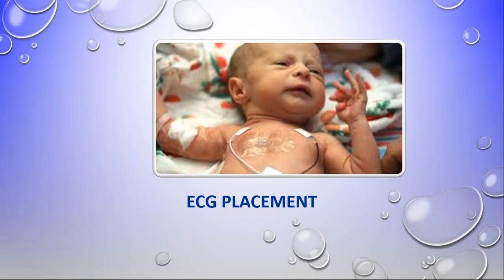ECG placement. Remember, we discussed that you needed the triangle of your ECG for the algorithm in your monitor to work, and that the triangle needs to be as wide as possible. Again, I make the point, never ever put an electrode over a nipple, because if that electrode by some horrid way removes that nipple, the baby's entire breast tissue, if it is a girl, is in that nipple at this stage of development. So please let us be very, very careful. Try and get your triangle as wide as you possibly can, and that will give you a better ECG reading. It is also very important that you know which goes where. So generally, it would be something like red, black, white, just so that you know.